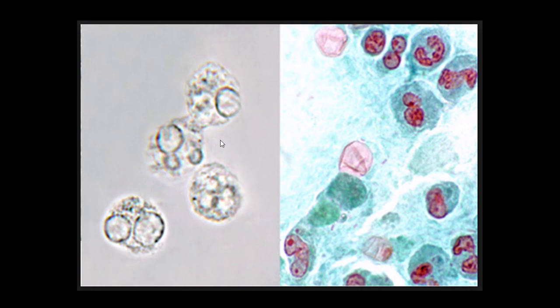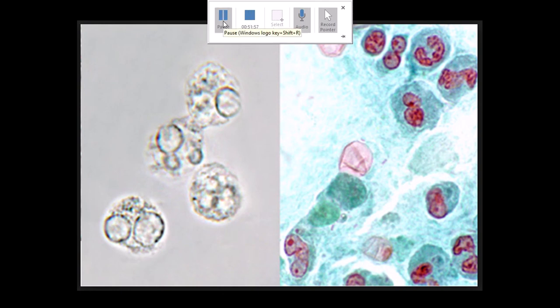If they are not present, that means it's a non-invasive type of diarrhea, and you can here differentiate or tell what are the possibilities of the invasive versus the non-invasive type of diarrhea.